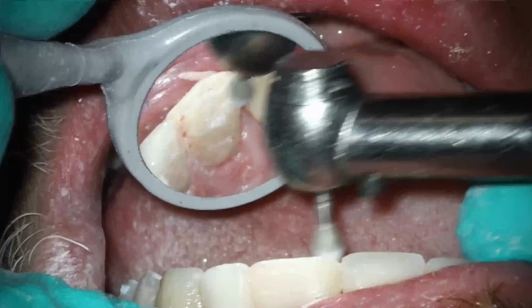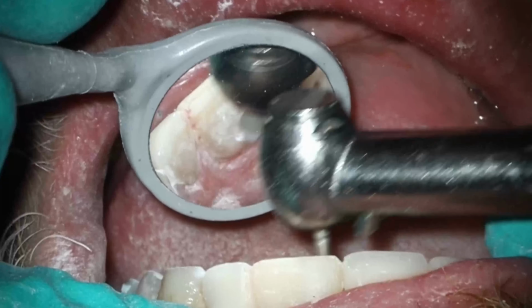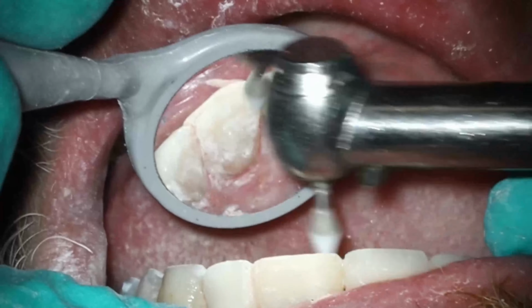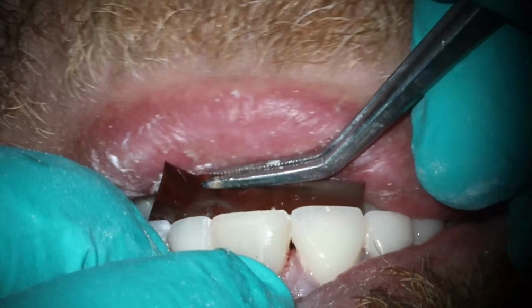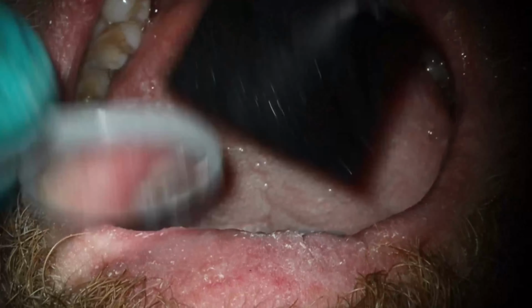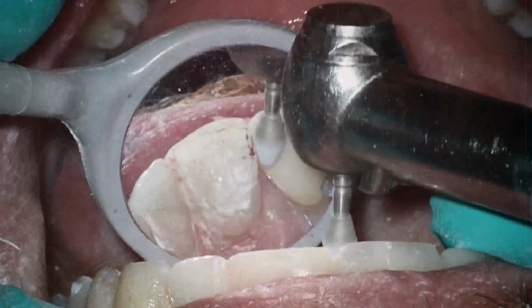It looks good. Now we're doing lateral guidance. And once again, if you see a mark on a tooth like this, take it out of the bite. It's going to get a new crown in a week anyway, so it's not like you're going to run into too many issues, but you certainly don't want this thing to break on you. Checking those again. And now we're going to do protrusive.